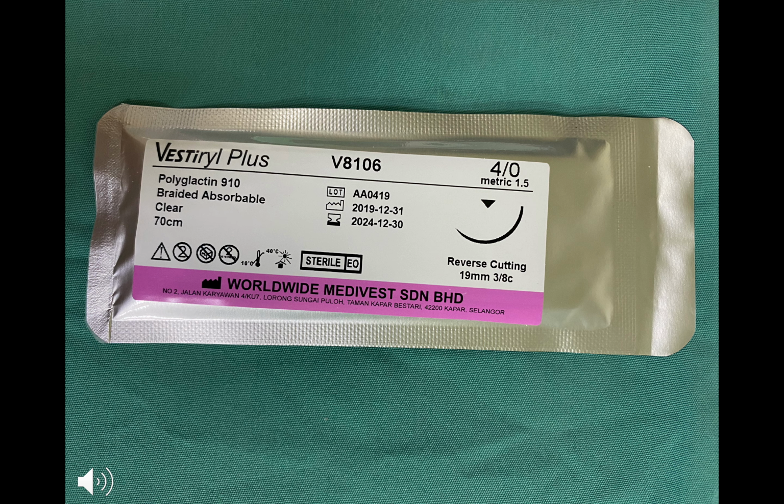And also need to standby suture material. It can be a 3/0 or 4/0 silk suture. And it can be used for, apart from wound closure, you can use it to hold the specimen or the lesion when you are excising it from the oral cavity. And also a nylon suture will be useful if you plan to retract the tongue, for example.